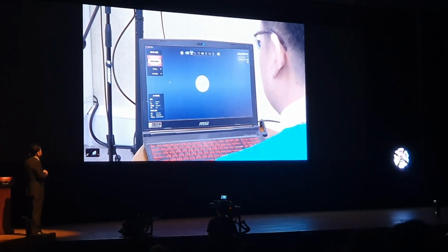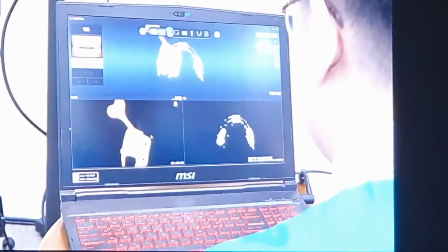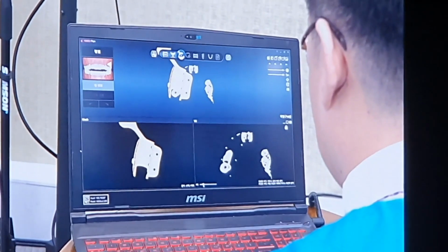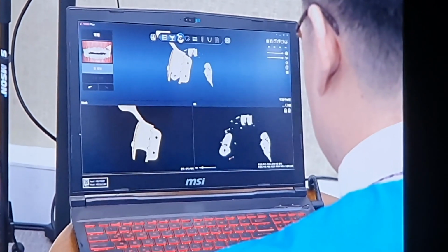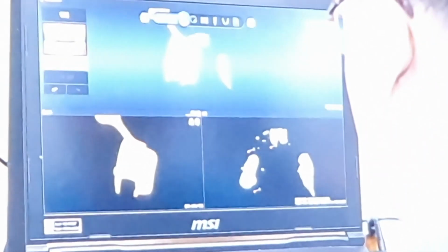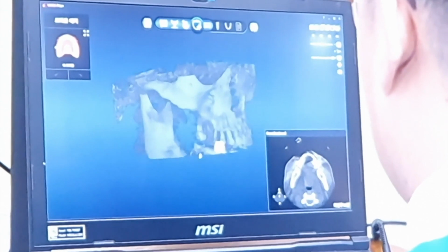So right next to me, we have a master dental technician who is helping us. As I'm using PGS13 in this case, this process is merging with the tray. The patient gets a CT scan, and the scan tray is used for merging. As you see here, there are 5 or 6 radiographic markers, in this case there are 5 markers, so we combined 3 out of 5 markers for merging. When we merge the 3 points, the PGS13S is finally merged onto the CT data.